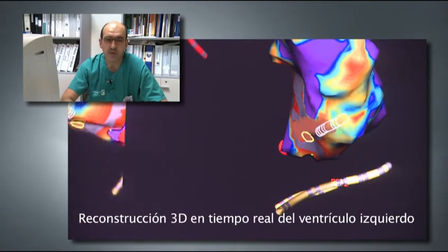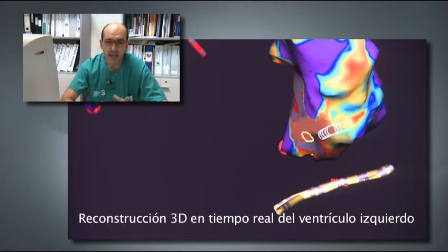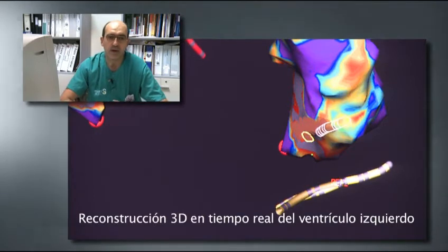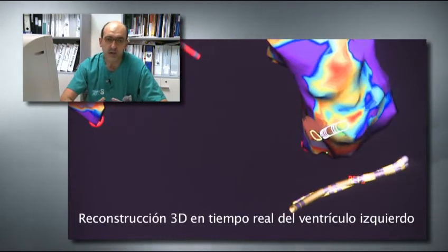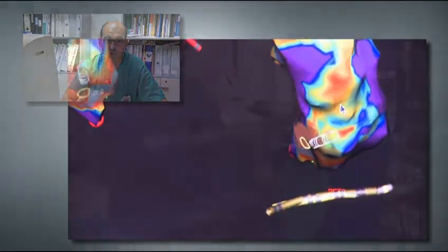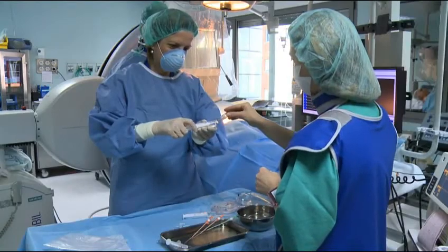Una quemadura con radiofrecuencia con un catéter especial para intentar acabar con esos circuitos y que el paciente no vuelva a tener taquicardias ventriculares o tenga el menor número posible. Se han introducido una serie de cables en sus cavidades derechas.